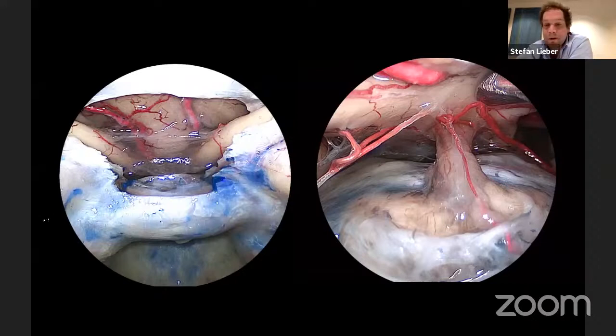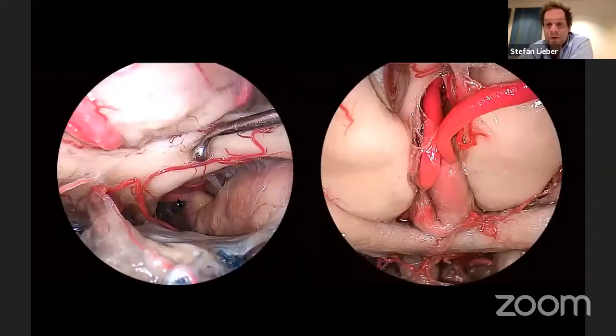This would be an approach infrachiasmatic and suprachiasmatic, for example, for craniopharyngioma, so suprasellar extension of adenomas. We have the stalk, we have the chiasm, we have the communicating segment of the carotid, branches of the superior hypophyseal, as I just said, connecting and supplying initially the chiasm and the Acom complex just overlying this. This is stepwise exposure of the pituitary and the dural relationships in between.